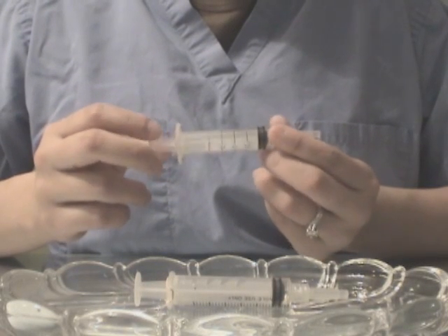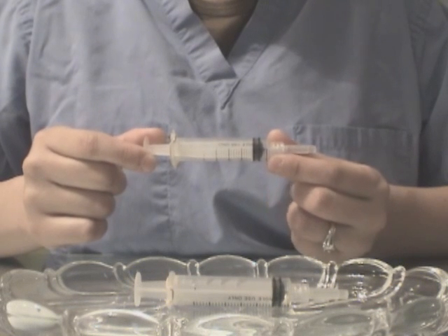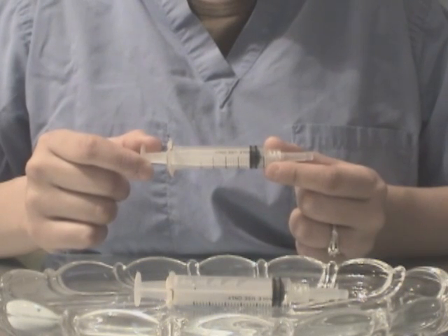How to use the safety syringe. This here is a safety syringe. Its price is comparable to a standard syringe and its usage is relatively easy.